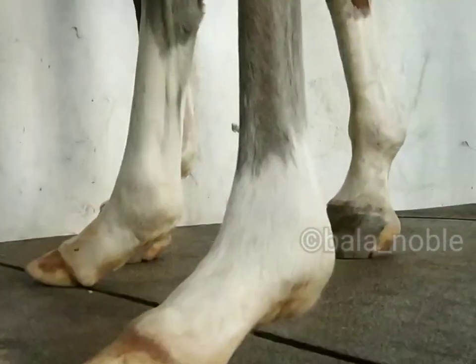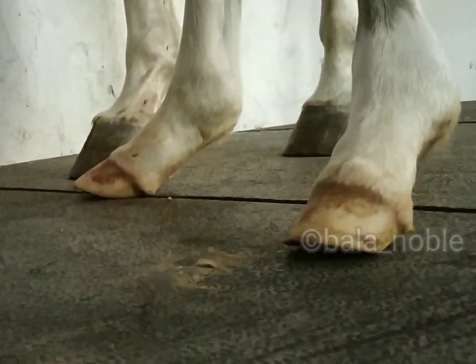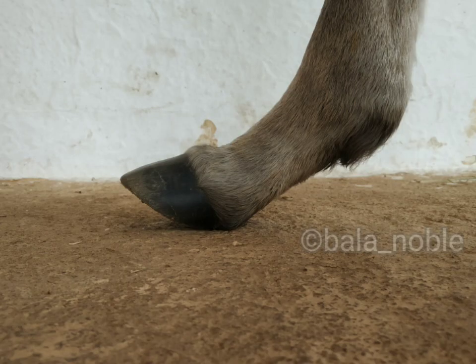It is commonly seen in premature or dysmature foals and the hind limbs are most commonly affected. Because of the hyperextension of the tendons, the toe is raised and the foal will bear weight on the fetlock or sometimes the pastern. In this condition, we have to give caudal extension.